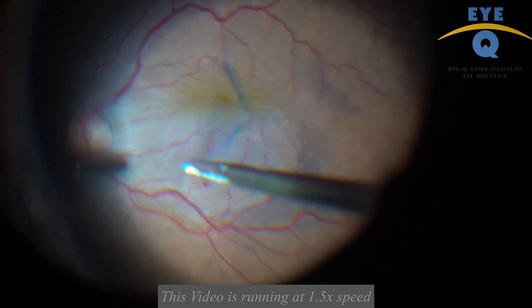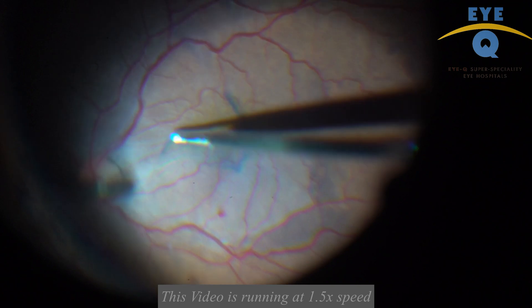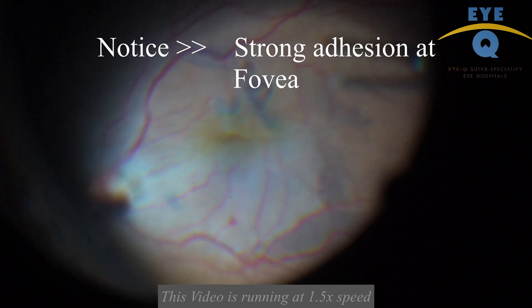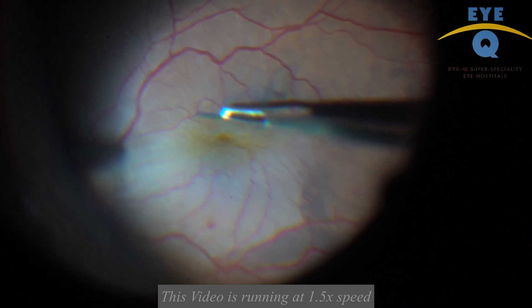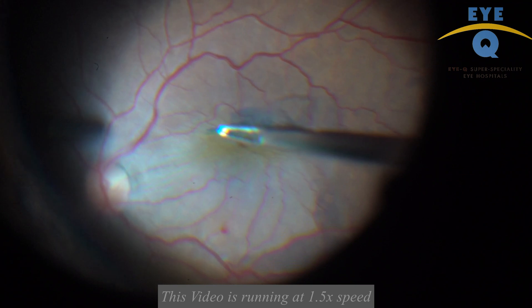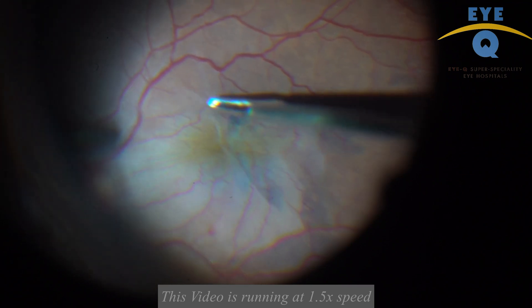Now, sometimes when you approach the fovea in a longer peel maneuver, you encounter strong adhesion to the fovea. At this point, one can change the plan and hold the ILM close to the fovea and peel with a centrifugal force directed outwards. You can again achieve a longer peel without avulsing the fovea.